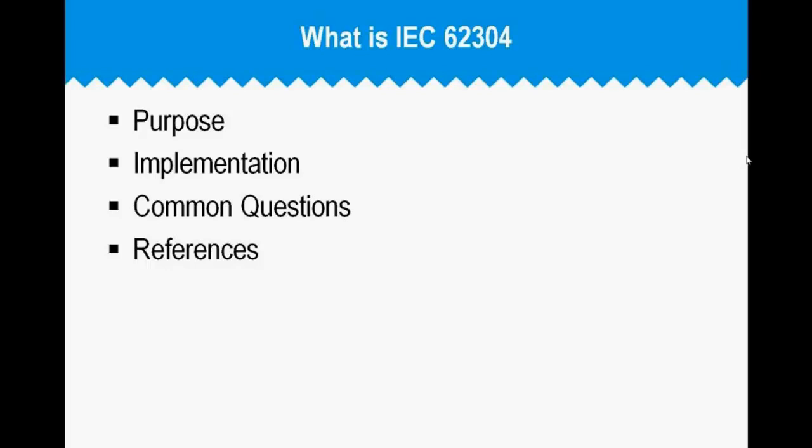One of the common questions I get, if they have awareness of it, is: how have you chosen to implement it? Usually when I consult into someone and we're having the discussion about 62304, I find it personally helpful, both as an internal document and as something to expose to external people, to take the time to briefly create a small presentation in whatever format makes sense and summarize your approach to implementing 62304.